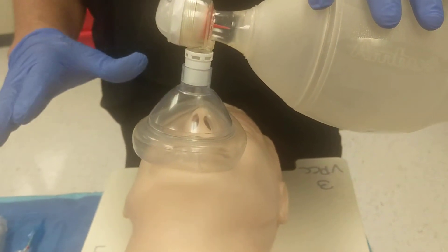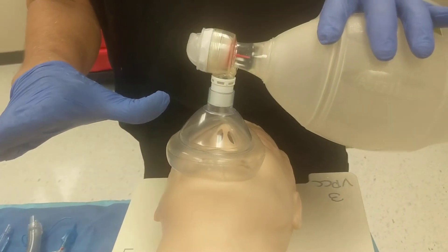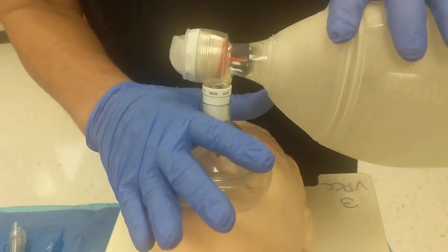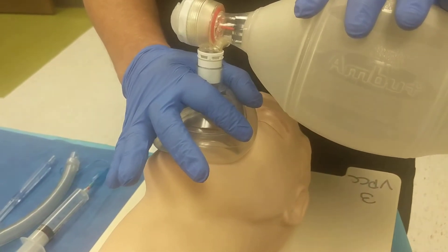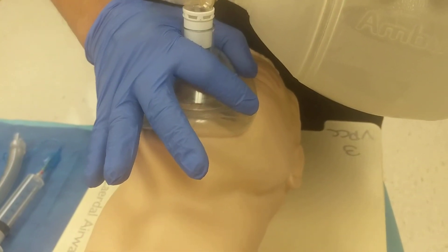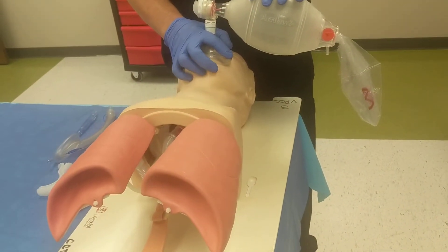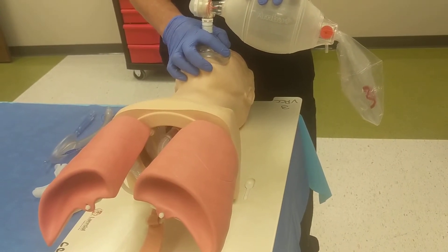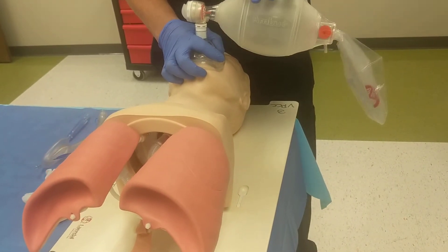If you're by yourself, remember the primary maneuver is posterior pressure of the mask. Spread your fingers wide, put your inner digital web up against the nozzle of the mask, take your index finger and thumb and push directly laterally, and then the primary maneuver is to actually push down and seal the mask on the patient's face. You may ask, why not just wrap your fingers around? You can certainly do that, but the risk is that under a stressful, high-adrenaline situation, you squeeze really hard and close the patient's mouth off.